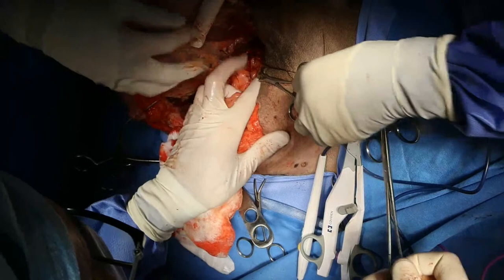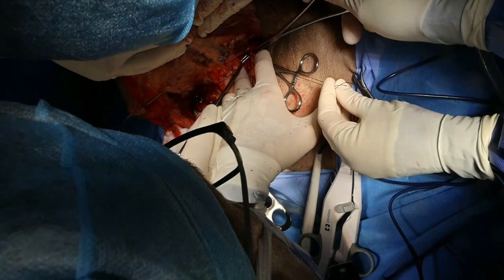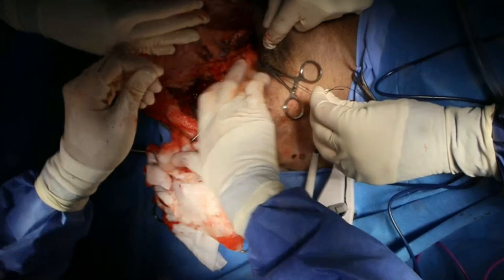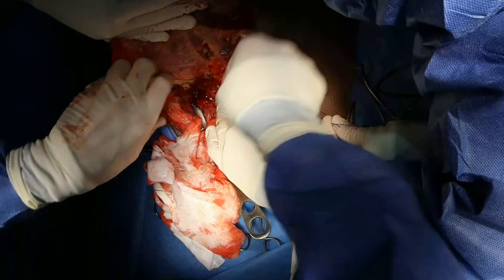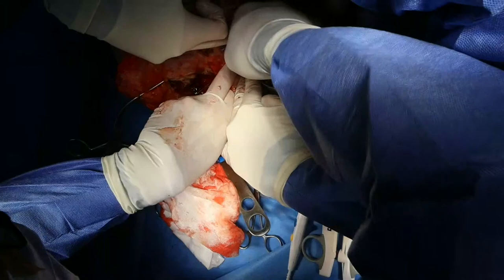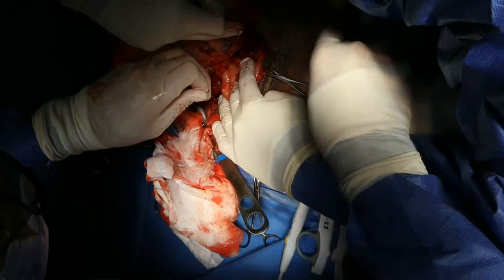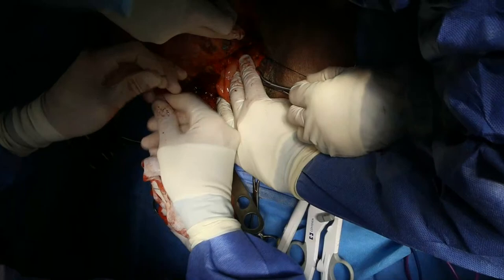I'll just hold on to that. Thank you. So now I have to tuck this as far in as I can because I have to make room for my scissors. Let's just try to get that abdominal fat out of the way. I cannot make much room here. Get a hold of this and pull on that a little bit more forcefully. I might be sorry, I can't see. You all right? All right. Still not a lot of distance there.